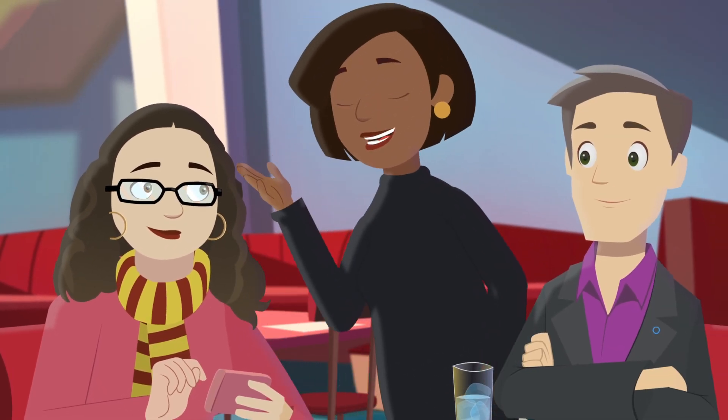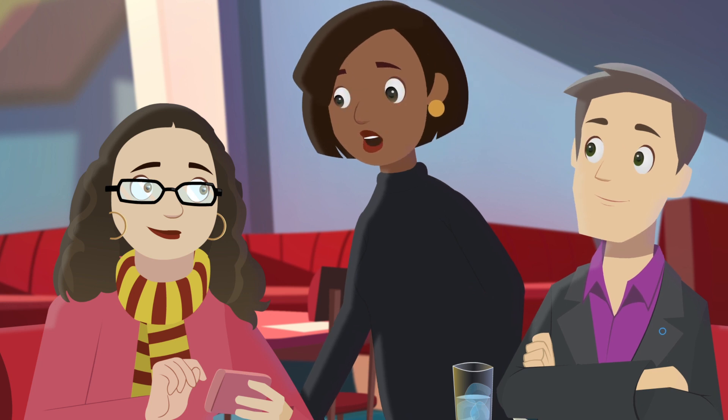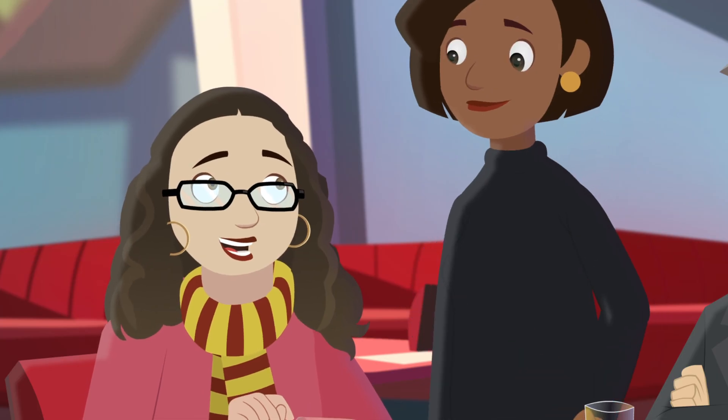Hey guys, one other thing — if you want to keep things hush-hush while waiting for your sensor to recover, just select alert silence in your pump.